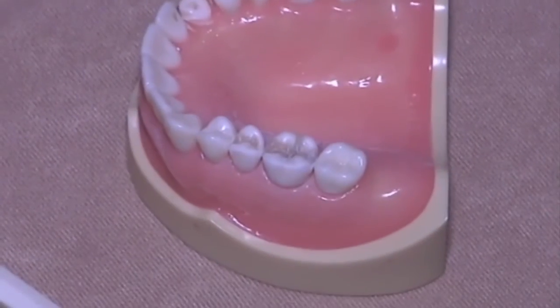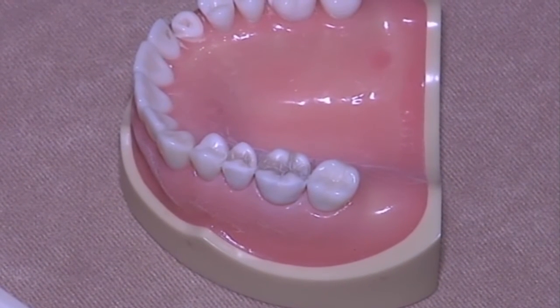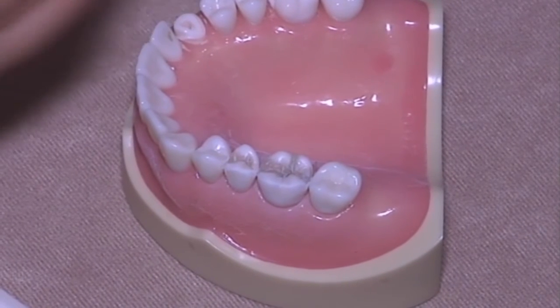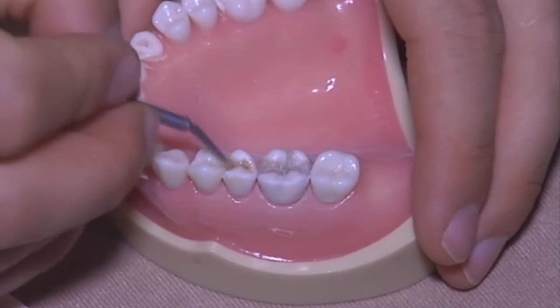Here we are. Okay, just a little bit of adhesive to remove the debris. In reality, here, just to clean and remove the debris, I use a little bit of alcohol.